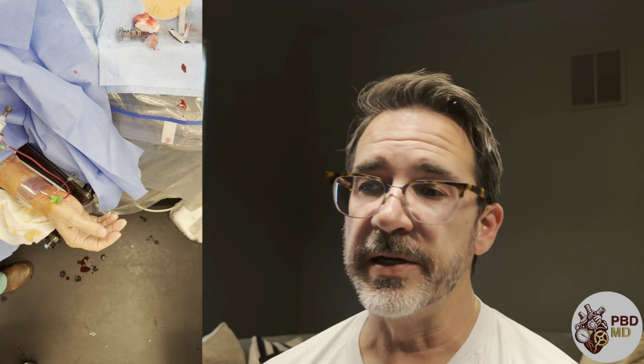So we don't want to totally stop blood flow to the hand. In rare cases, the vessel can clot off altogether and then can be gone for life. Interestingly, it doesn't usually cause a problem with the hand. It's more just its loss of access. Sometimes that vessel can get used, like for bypass surgery. And generally we want to keep things open when they started open.